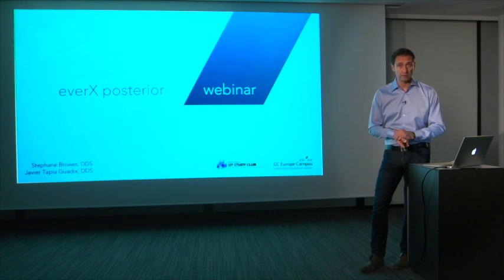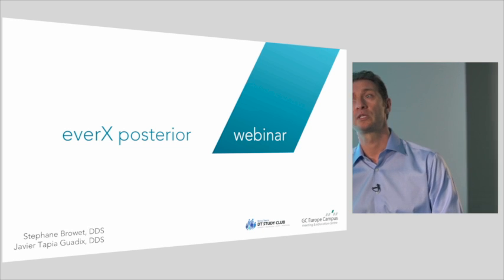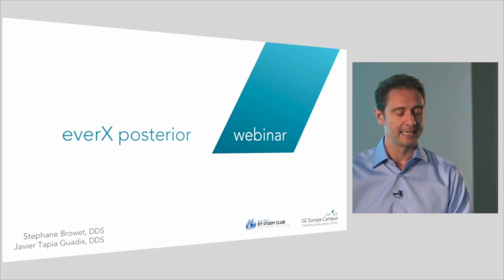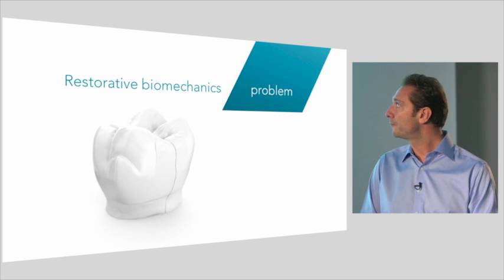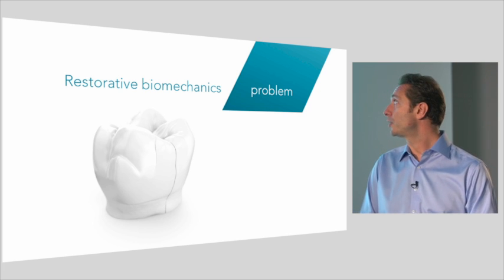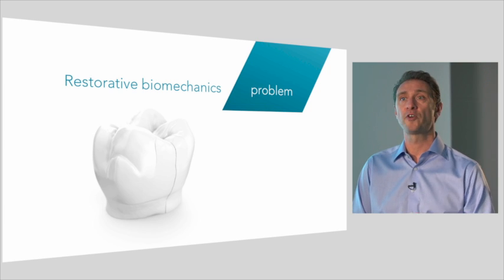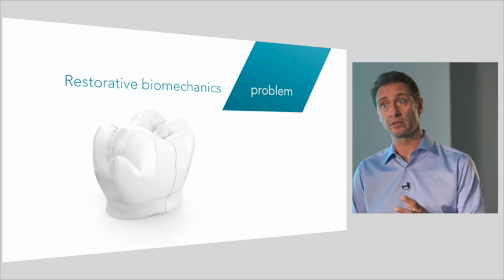As you know, we will focus on the restoration of large-sized cavities. The evidence shows us that the biggest challenge of today for dentists is to meet some criteria: restoring teeth that are severely damaged and creating a complex that is functioning very well in terms of biomechanics. And we will have to look at the biomechanical features of teeth and also the biomechanical features of the restorative materials.